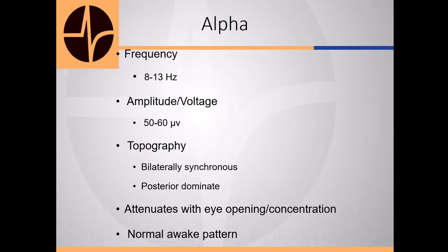When you do EEG, the tech will give a technical description of the EEG, and they may say that the background activity of this patient is 9.5 hertz, which is the correct EEG speak, let's say. But I've had people say that the patient's alpha activity is 7 hertz.